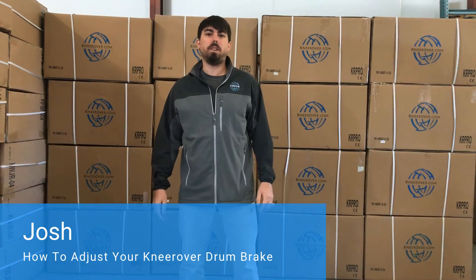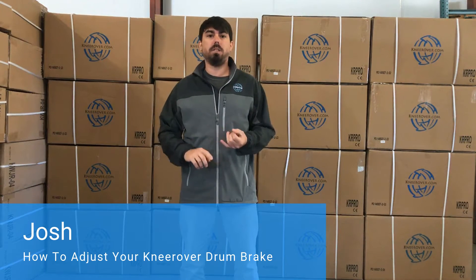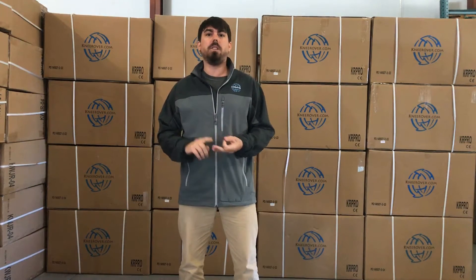Josh here from KneeRover.com. Today we're going to do a brake adjustment. This brake adjustment will work on the Knee Scooter, the Knee Cycle, the Knee Walker Jr., and the Evolution models.